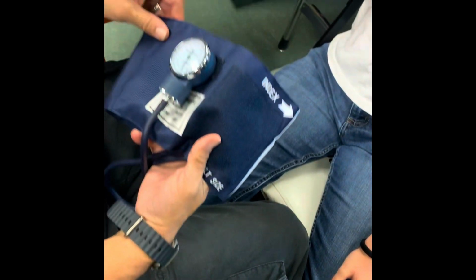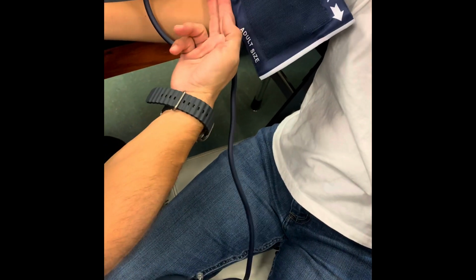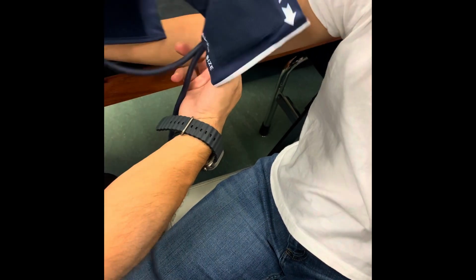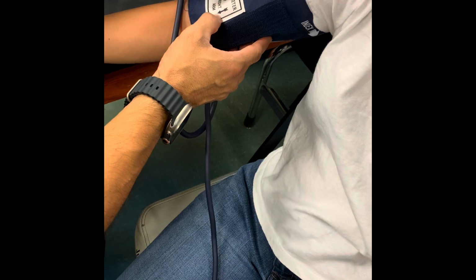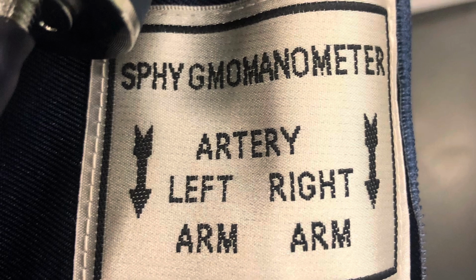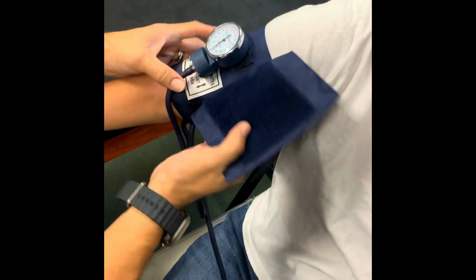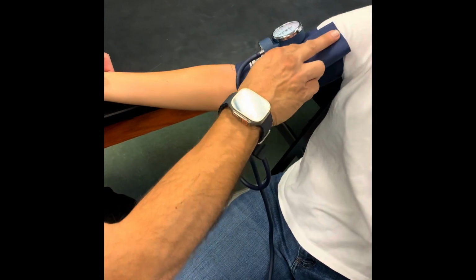All right, and so then what we'll do is we're gonna use her right arm, and then I'm gonna place this about 2 fingers width above the crease of her arm. Can you bend your arm for me? See, there's the crease. We're gonna go about 2 fingers width, which is about 1 inch above the crease of her arm. And this is the right arm, so we're gonna place this cuff right over the brachial artery, and this arrow shows us where that brachial artery should be. It's right in the middle of the arm. We're gonna pull the cuff pretty snug, okay? And then you might have this extra flap, so we're just gonna kind of tuck it inside.